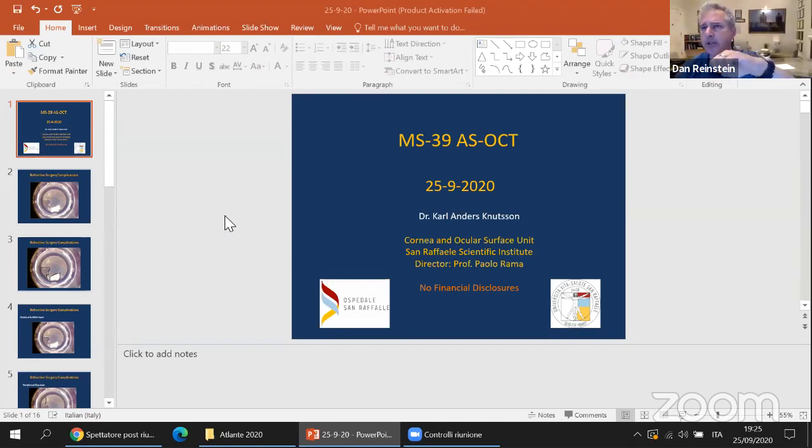this is a myopic patient? Yes. I actually would have taken some scissors, some Vannas scissors, and I would have cut around that. And I would have left that triangular section in situ, and I would have lifted the flap minus a triangle in the corner, and I would have performed the ablation. If the transition zone might have encroached on that area, I just would have removed the epithelium from the surface, so that the ablation is not truncated. And I would have put the flap back very carefully without overhydrating, so that there's no gutter or no gap in that region.